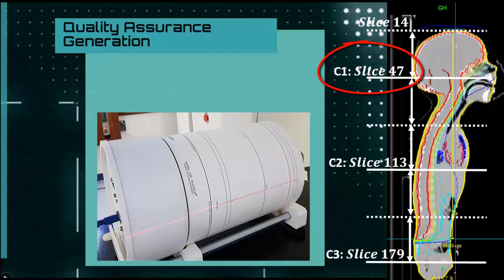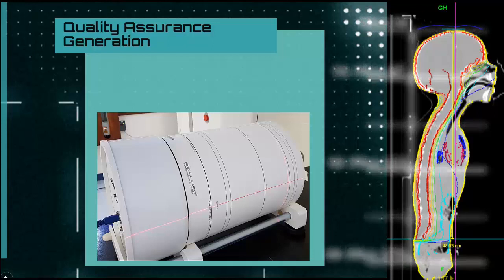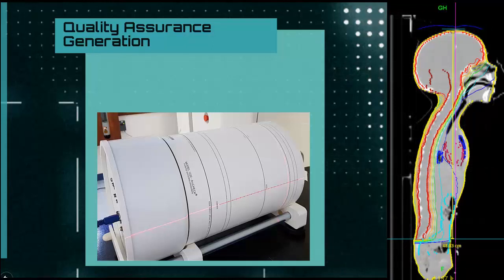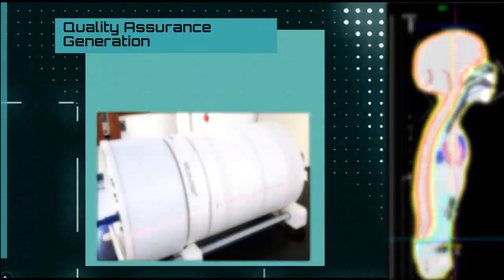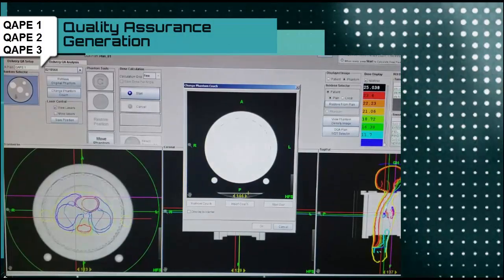The three centers are on tomograph slices 47, 113, and 179. Once this is clear, we'll head to our planning station, open the DQA software, and begin to generate our quality assurance. At this point, we select our patient for whom we've done the quality assurance. The first thing we do is place a name for the quality assurance — in this case, we'll utilize QAPE1, 2, and 3.